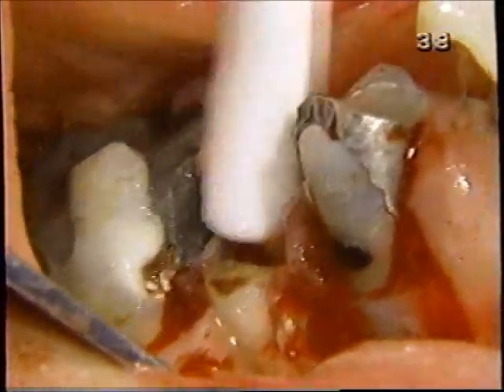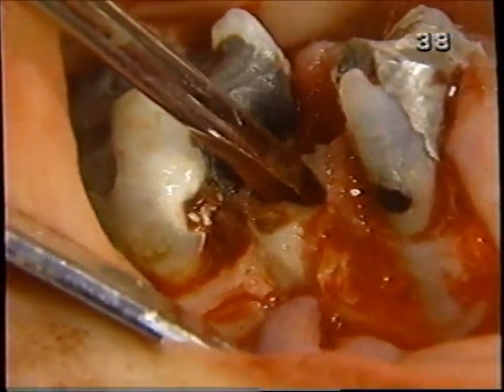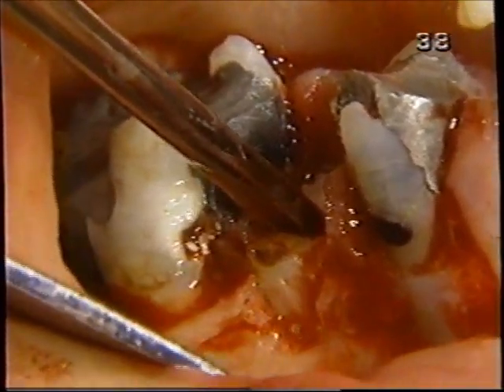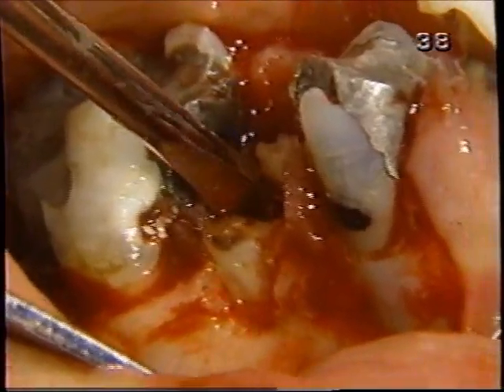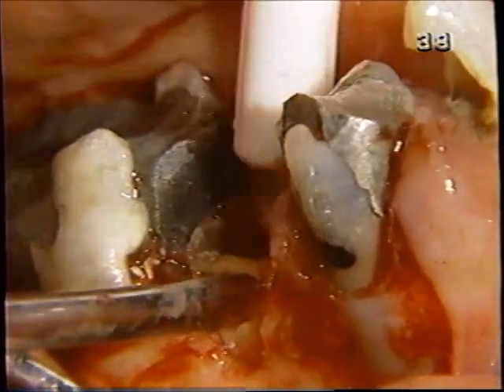All right, now 301. See, the tooth is actually moving. Now, put the 301 down there as far as we can get it. Okay, we got part of it there.